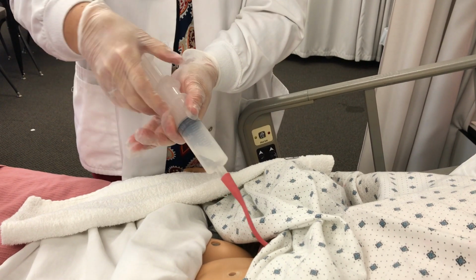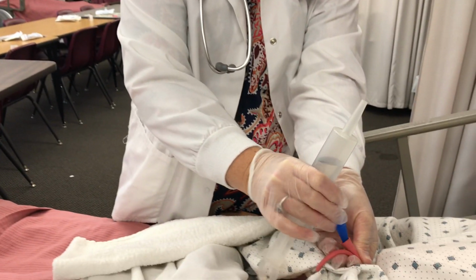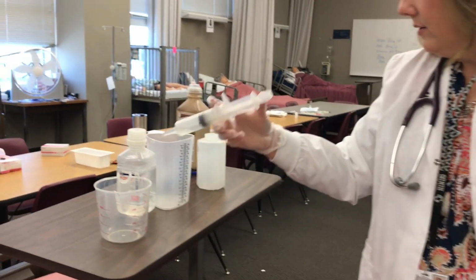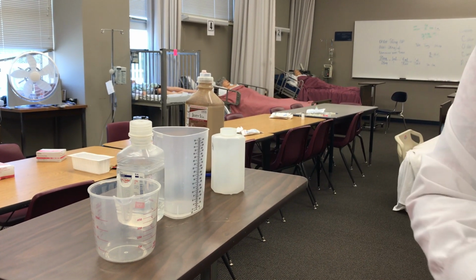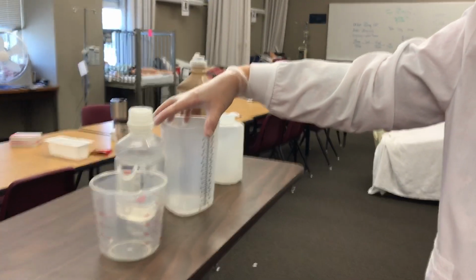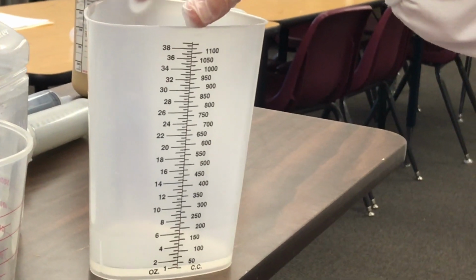It's going to be important to measure this. So clamp it off, disconnect it. I'm just going to hold this here for just a moment because I need to measure it in our container over here. Sometimes it's best to use a smaller container. So I will chart that my client has, we can say that that is probably about 25 cc's of residual.